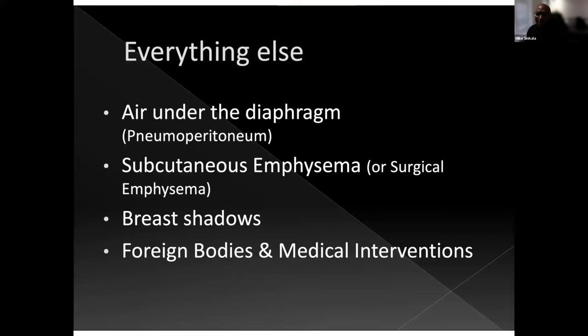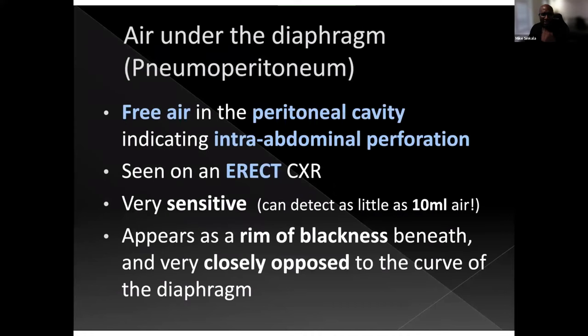an erect chest radiograph. In fact, before you do this, if the patient came on a bed, lying flat, they should wait for at least 15 minutes before a chest x-ray is done. It is a rule. The rule is that if there is any perforation of the viscus, if there is any pneumoperitoneum, the patient should be given time for the gas to start rising, to be trapped below the hemidiaphragms, as it were.